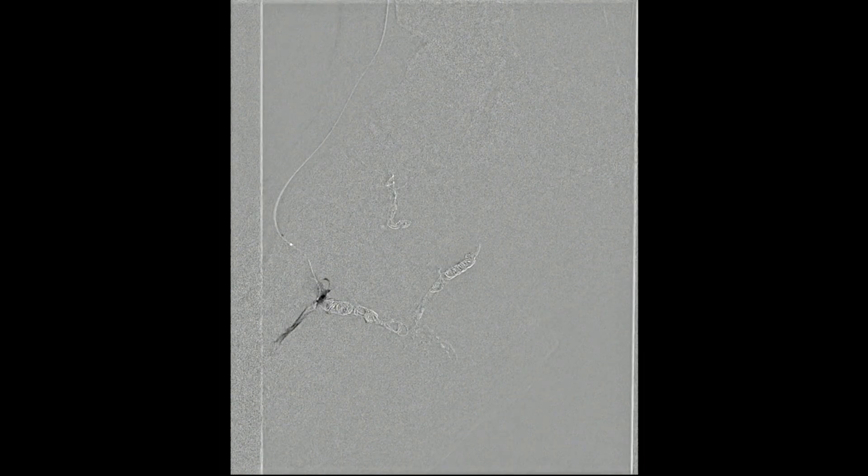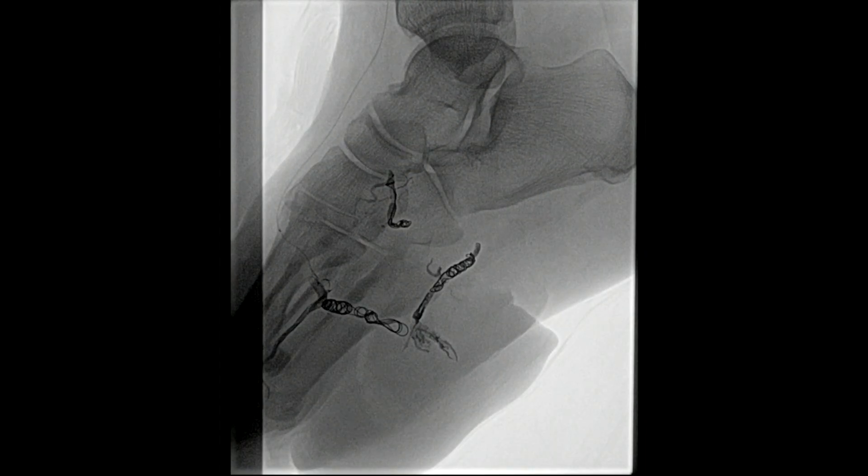You sit and wait for the onyx to solidify — usually leaving it for one to two minutes for that to happen. Then you continue to inject and it usually follows a separate pathway. In other words, the plug which has been formed pushes the onyx down in a different direction. You can see the plug coming up the main feeding branch to the malformation.